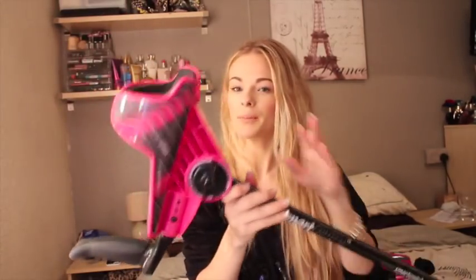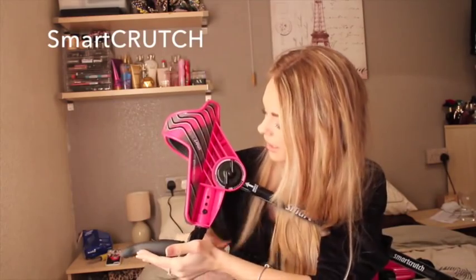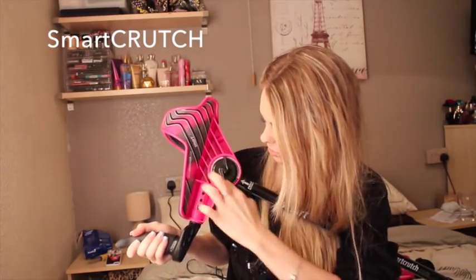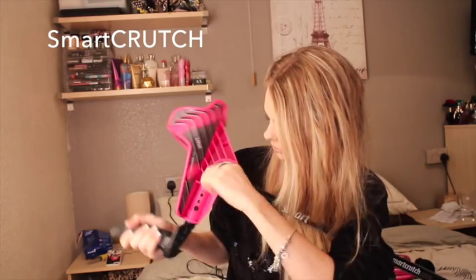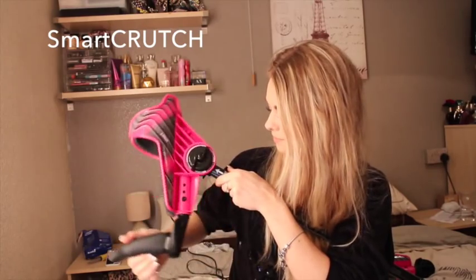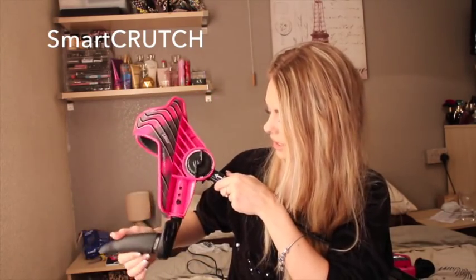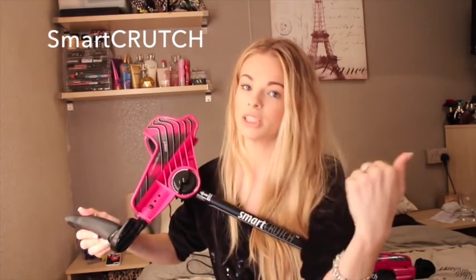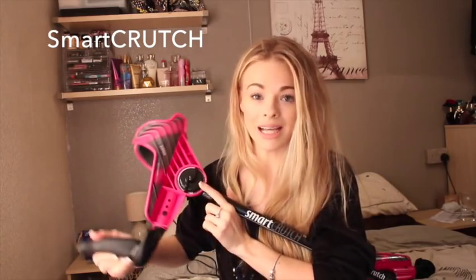So the product I am talking about is the Smart Crutch. It's a bit big to get the whole camera, but this is the top of it. So it has an angle — you can change the angle of the crutch. And it tells you exactly what angle you've got it on, so that if you want to adjust the second one to the same height and angle, you know exactly where it is.